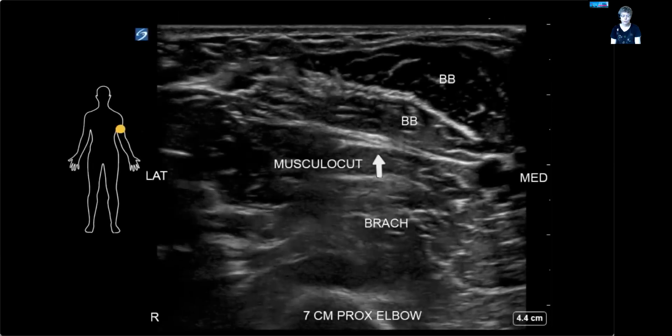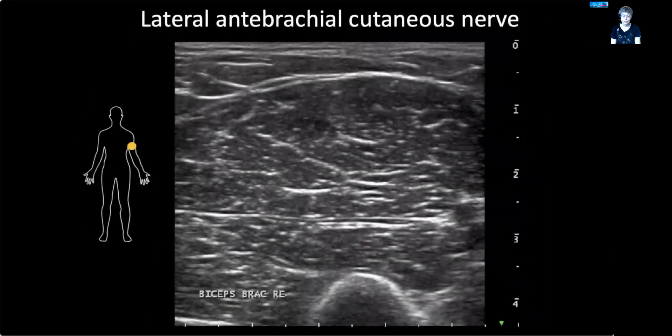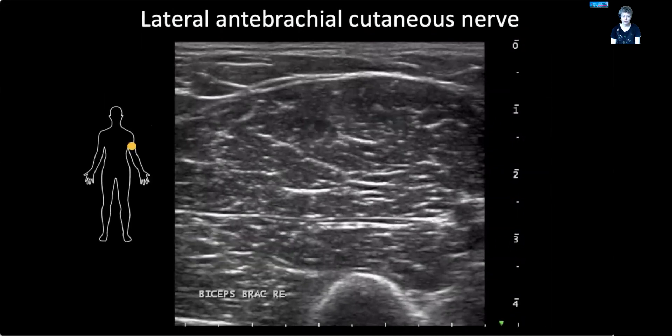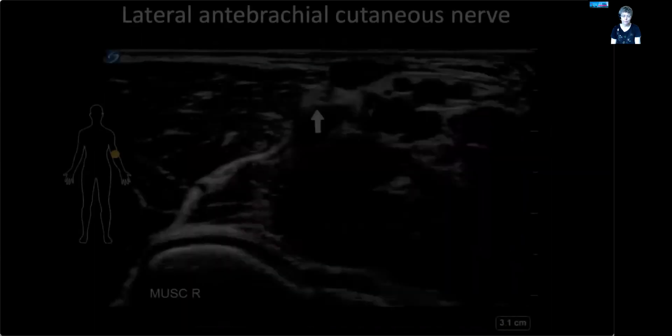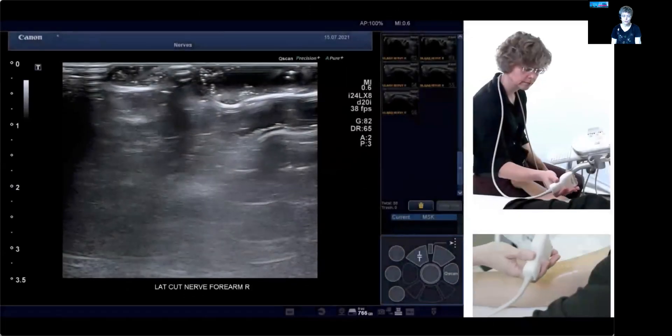Here's a close-up still ultrasound image of the nerve in the mid-upper arm between the biceps and brachialis. You can see the nerve highlighted in the fascia lining between the two muscles. Here you see it at the elbow level — below is the elbow joint with the cartilage, and the nerve is right superficial there.